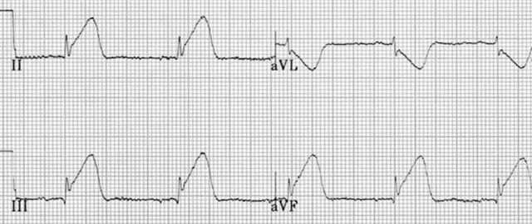They're labeled differently. So Nick's going to help me without any inappropriate touching, as we've talked about many times before. I'm going to be EKG man with chest pain, if this is my arm and leg.